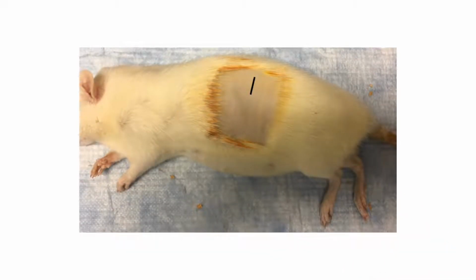But before directly performing this in rats and mice, you need to shave the area where you want to image, because there are so many furs on the rat, and that will actually give background color.